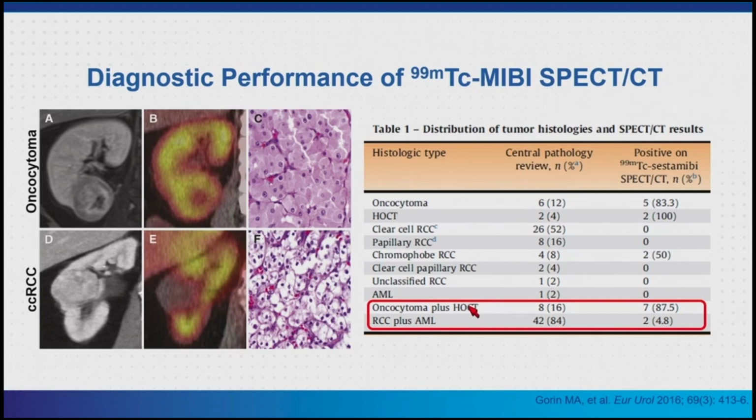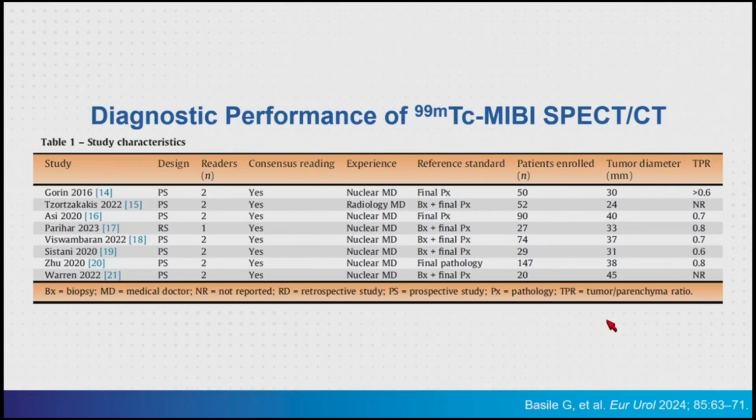Nowadays we refer to these as oncocytic RCCs, which is thought of as, while it is malignant, its behavior is virtually benign. And in terms of false positives, we saw only about a 5% false positive rate, and it turned out that the false positives were both chromophobe RCCs.